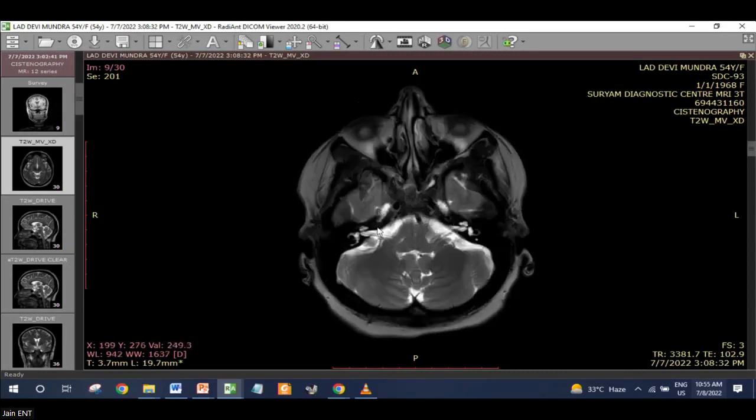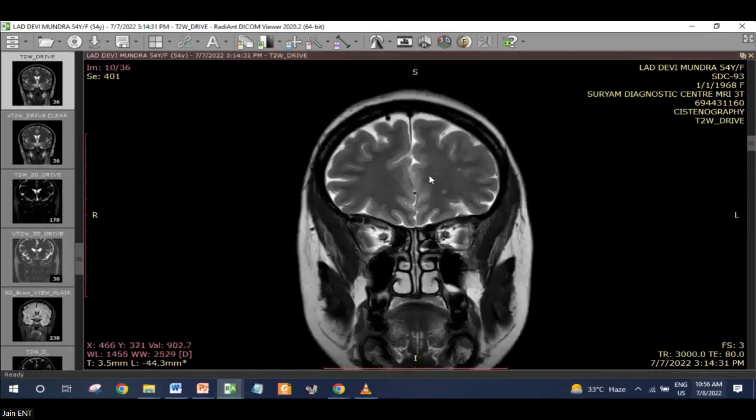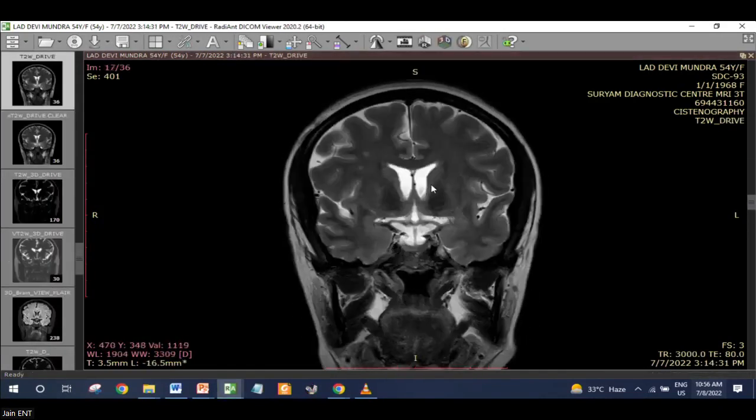This is the Meckel's cave. In many patients with raised ICP, we see a dilated Meckel's cave. Meckel's cave is nothing but the fluid-containing space where the trigeminal nerve traverses. So we can see many other indirect signs of high intracranial pressure in these patients, and we need to be very careful in picking up this situation and explaining it to the patient, because this leak can be a manifestation of high pressure.